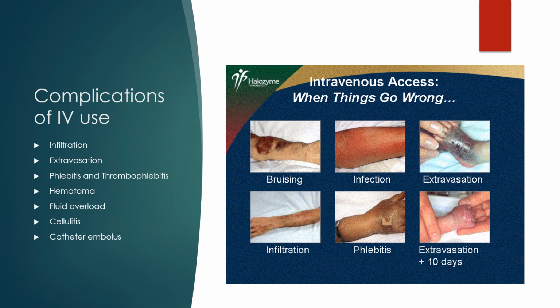We can't guarantee that it was placed using sterile technique. We can also do really good hand hygiene when we're caring for these, wearing gloves anytime we're touching the patient's IV, and really making sure we use that surgical asepsis or that sterile technique when we're accessing the IV so I don't give them an infection. A lot of times with the phlebitis, you're going to see redness, warmth, edema, pain streaking up from that site.